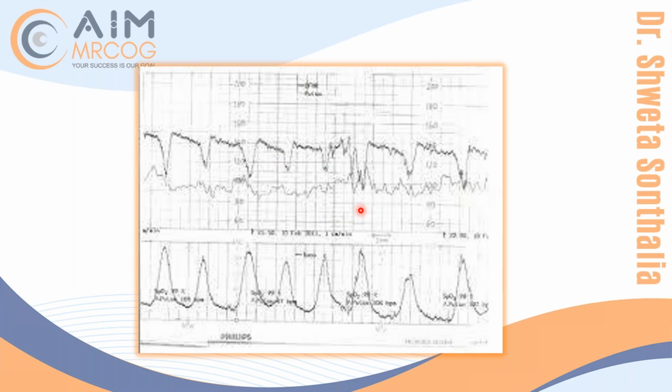Some of you told it is a normal CTG also. Again and again, I'm telling you, all decelerations are variable decelerations until proved otherwise, like we say any pregnant woman having a fit has eclampsia until proved otherwise. So please open your eyes and see. You cannot see it as normal, because where is the baseline? This is the baseline. Where is the acceleration? Where is the variability? All are decelerations, and they are not early.